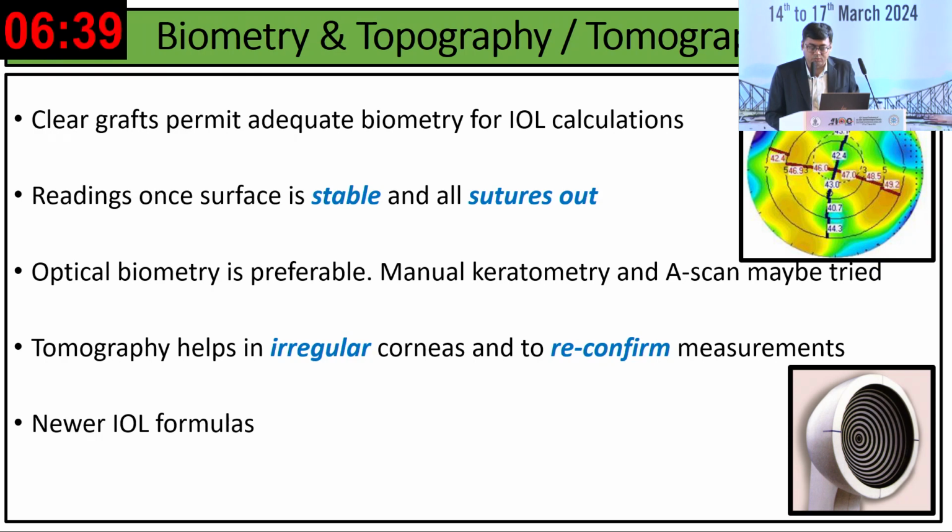Tomography helps in the irregular corneas. Mostly these grafts, the sutured grafts, are quite irregular, and it also helps to reconfirm the IOL power and use the newer IOL formulas.